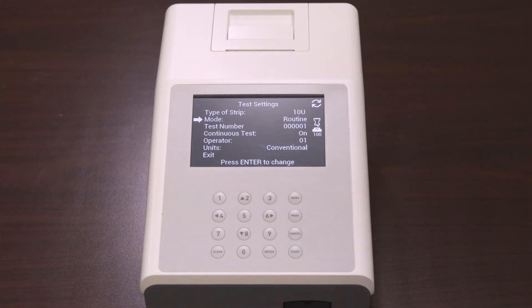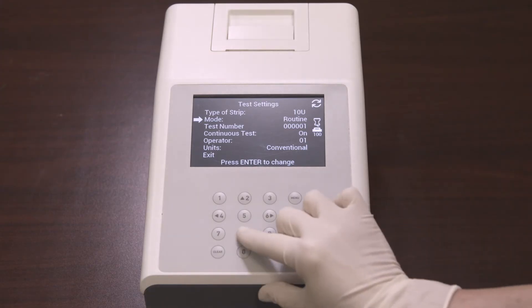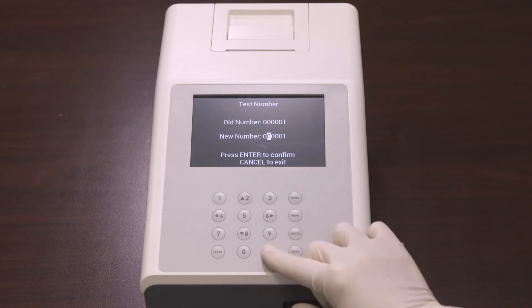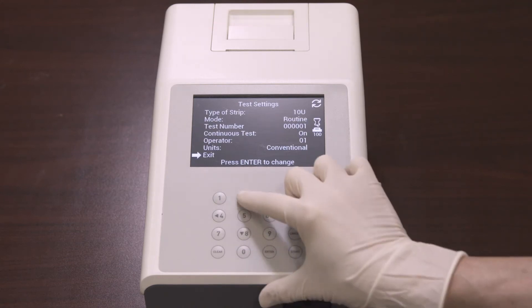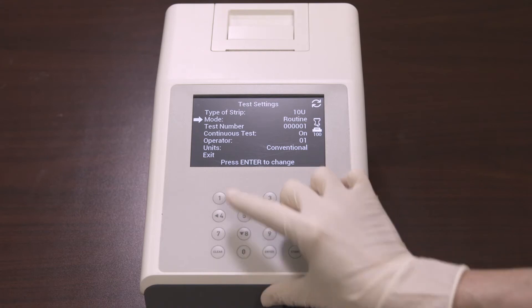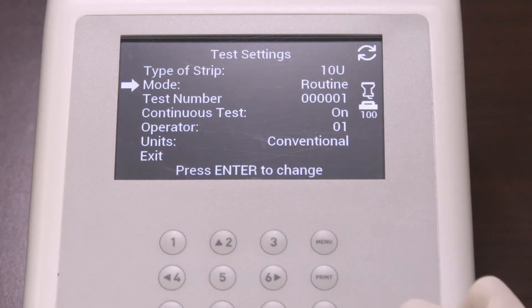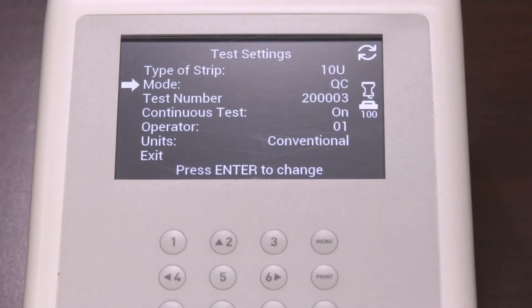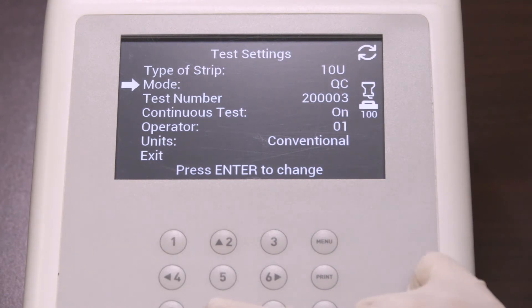You can also select the test number and enter a new test number, then press enter to confirm. The first digit in the number will depend on the test mode: the first digit will be zero for routine, one for stat, and two for QC test. The first digit is fixed and cannot be changed.